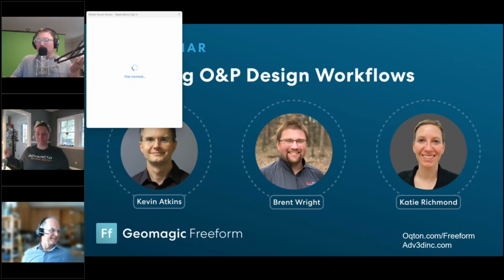So, but you can use, well, I don't know, can you do a PDF file or does it have to be a picture? We can import into Sketch like all the image formats, so JPEG, BMP, etc. And then we can import AI, we can import DXF, and I'm pretty sure we can import IGES. I think we'd have to double check that one.